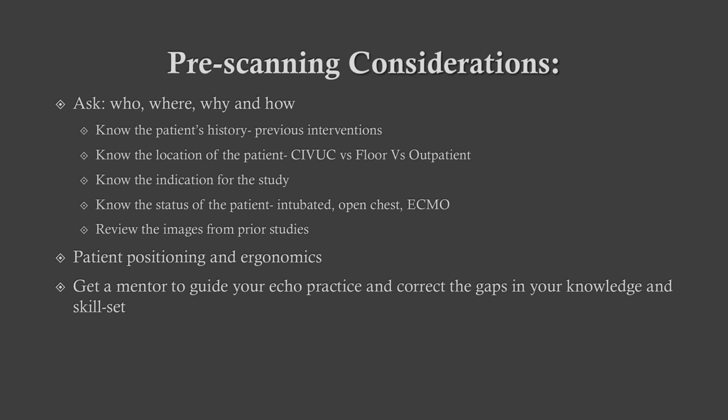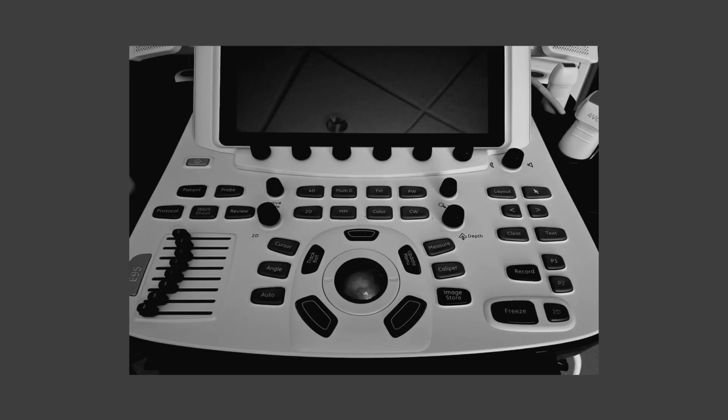If the patient had a prior echocardiogram, it's important to review the images and make sure you get a mentor to guide your echo practice and correct the gaps in your knowledge and skill set. Once at the bedside, be mindful of the importance of patient positioning and ergonomics. The ultrasound system I will refer to during our presentation is a GE E95 ultrasound machine.